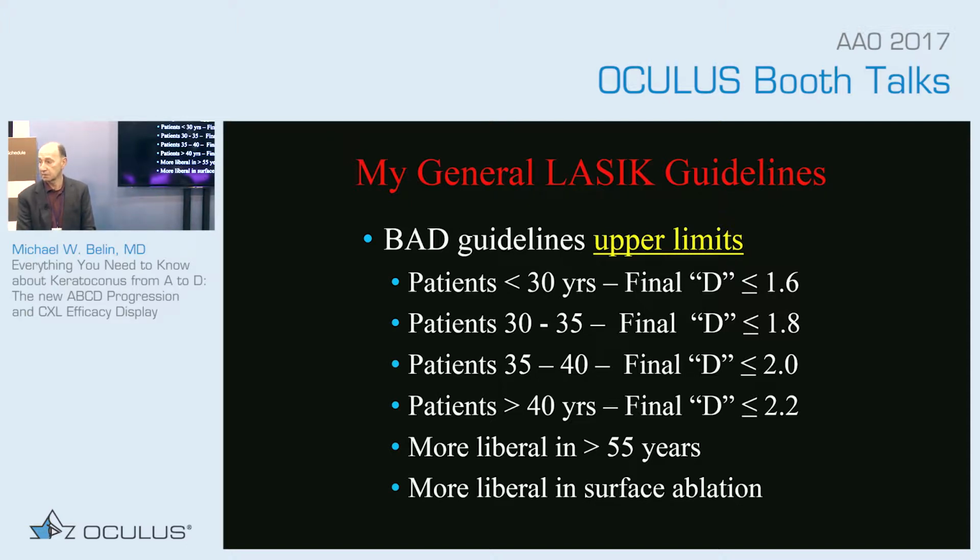And that's despite the curvature, there's any asymmetry in the cornea? Yes. So you will still proceed with LASIK? Well, asymmetry is one of the most over-diagnosed. Anyone with an angle kappa will have asymmetry, but will still have orthogonal principal meridians, which is why we don't show you curvature maps, because while they may be sensitive on the anterior, they're very non-specific. Anyone with an angle kappa will give you an abnormal or asymmetric map, but still will have orthogonal principal meridians.